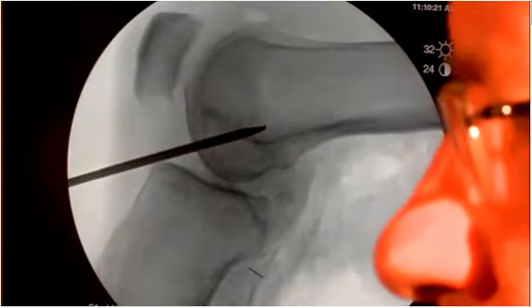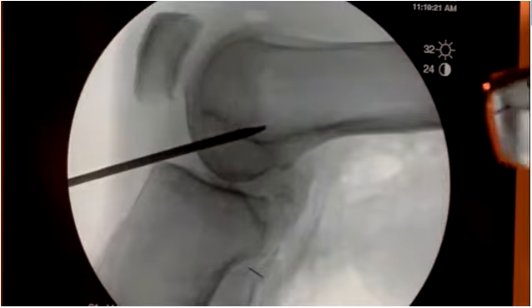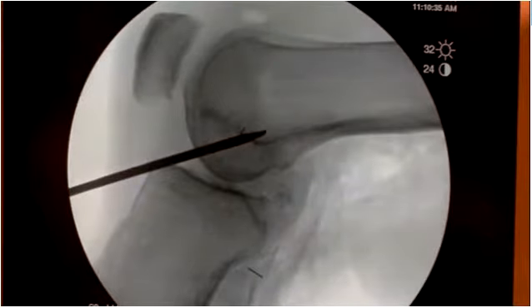Do you agree, Charlie? I might go a little bit more posterior? More posterior. Yeah, right. So again fluoro. So here again. Yeah, somewhere about there. Do you guys agree with that position? I think that looks good. Any questions from the audience on this?